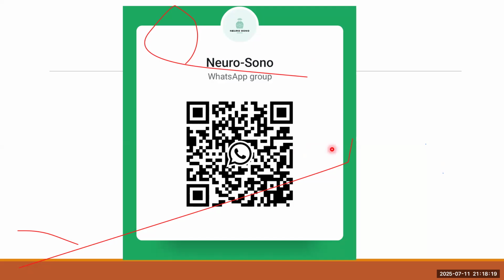Anything? Sir, I have just a few things to emphasize. Overall a wonderful presentation, where we have touched almost everything, so that we know what waveforms we are getting and how to interpret them. What I do in my practice is that once I want to see any TCD, first I note down hemodynamics, because at what hemodynamics we are getting these velocities should be known. We need to correlate, number one. Number two, if I have to see one parameter which is most important, I feel it is PCO2.